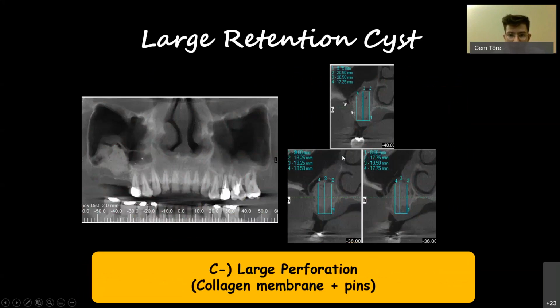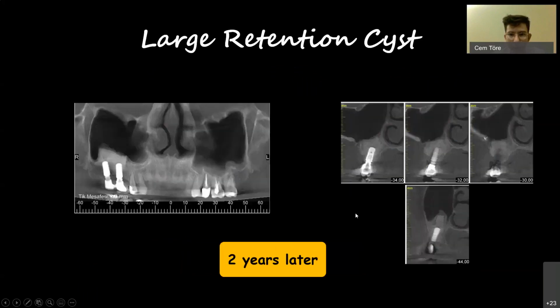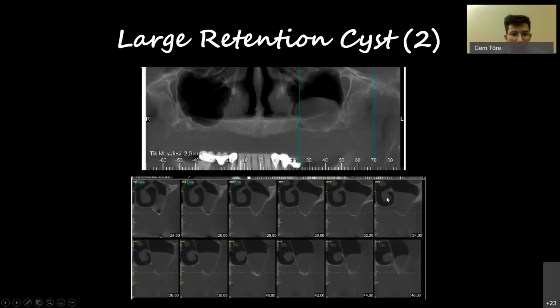This is the after tomography. A huge amount of bone is created. Some residual cyst is still there. This is 8 months, 2 years. Still more bone than we can need.